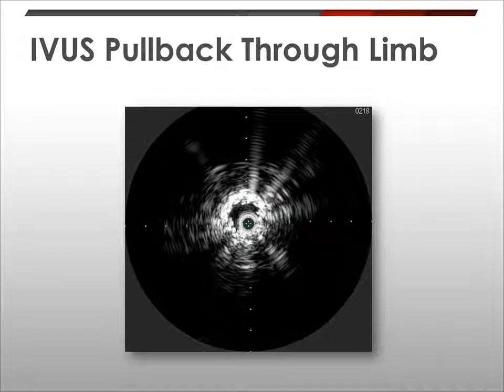It's surprising to me how often we find iliac stenosis like this, even though the angiogram appears totally normal. If the stenosis takes place in an anterior to posterior geometry, that could only be identified if you move the image intensifier to 90 degrees.